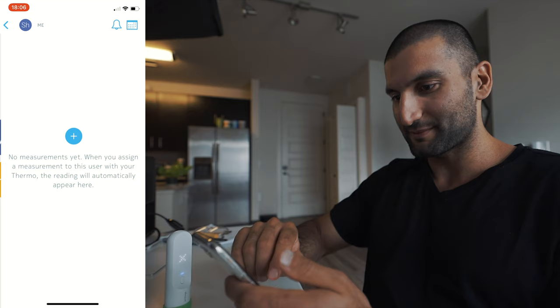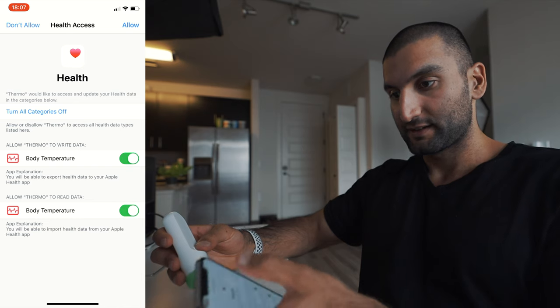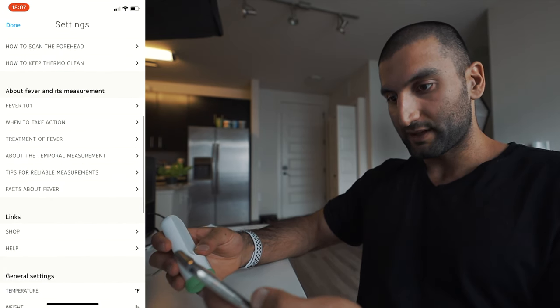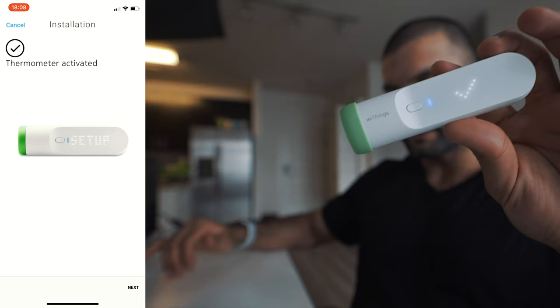Not the greatest experience for a smart thermometer here. It's not showing an X because it's dead. You can also allow health access, so body temperature will now be in my health app. It's got the how to scan, fever, when to take action, links, general settings. Activating your thermometer — check mark means we're good.